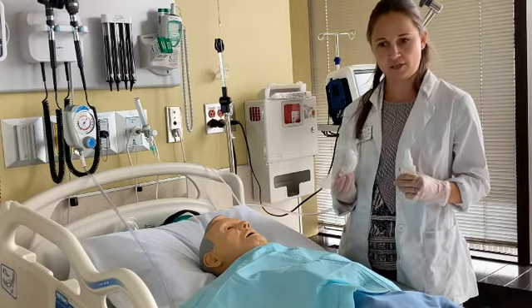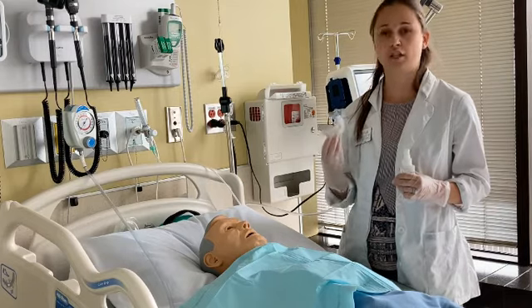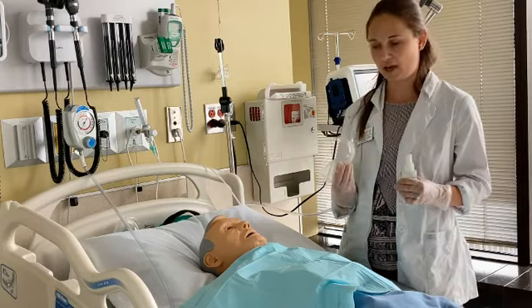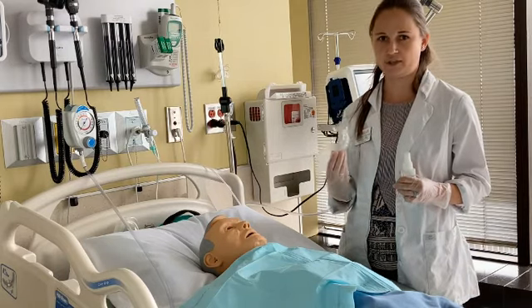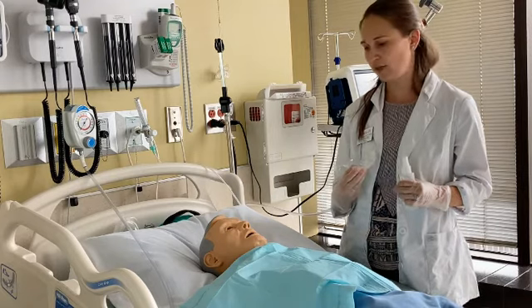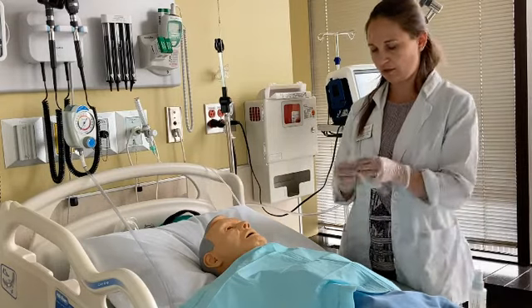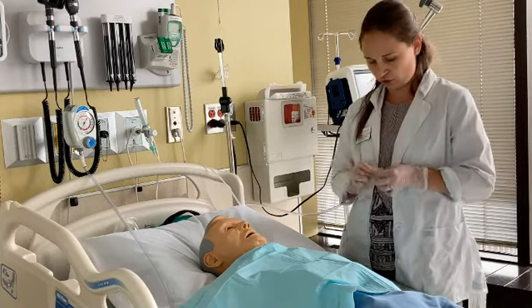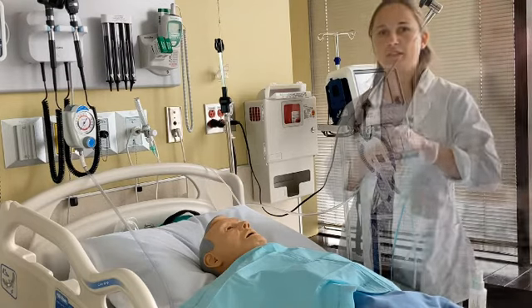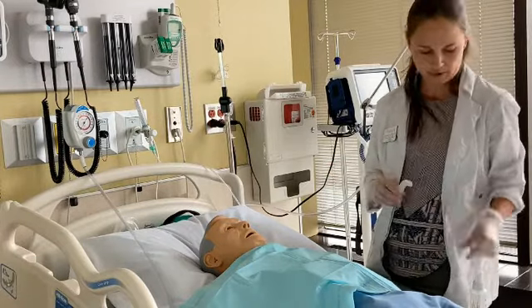If the patient is in respiratory distress because their airway is compromised and they are unconscious, this airway is a good choice because it's very easy and fast to insert, and you can successfully ventilate the patient with an ambu bag through this airway. So this is what we're going to do. First things first, I need to measure my oropharyngeal airway to make sure that it's the right size. This procedure is clean. It does not have to be sterile, even though they come in a sterile packaging.